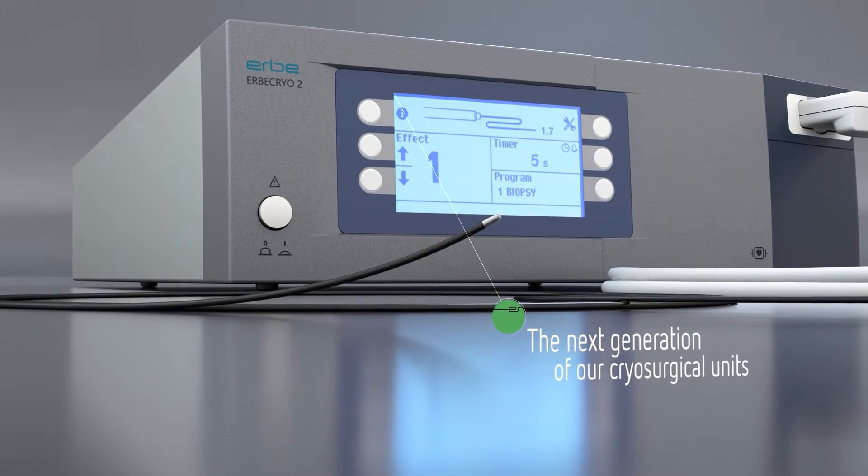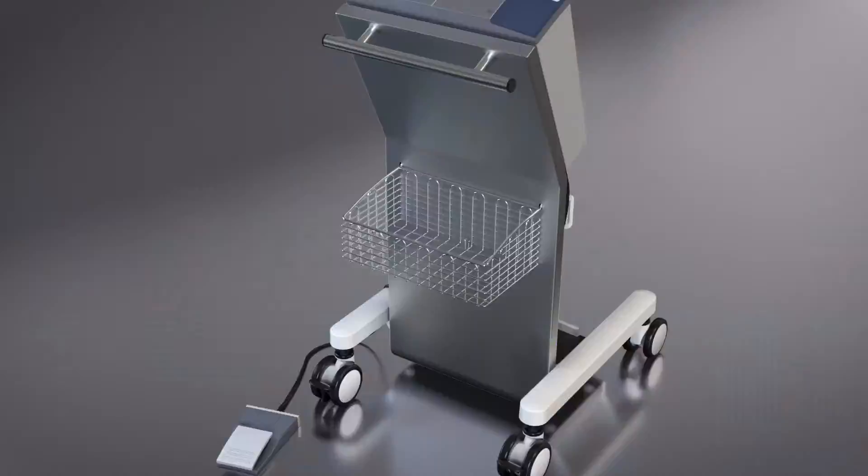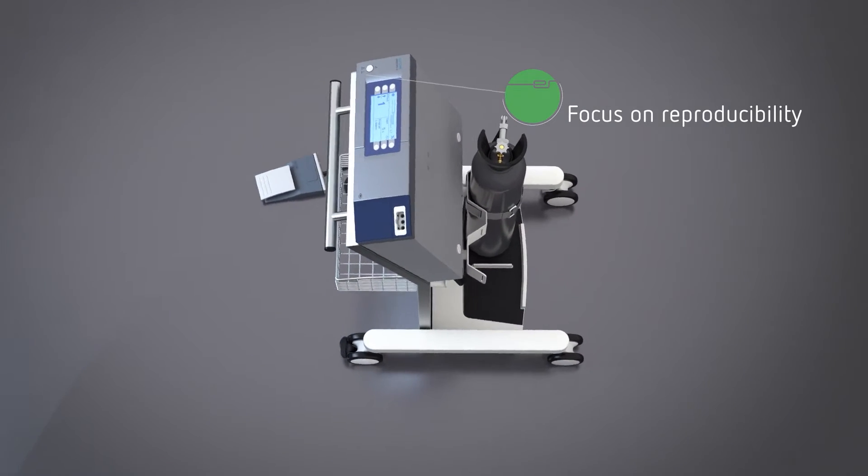The ERBECRYO 2 is the next generation of our cryosurgical units and was designed with a focus on improved reproducibility for state-of-the-art flexible cryo applications.